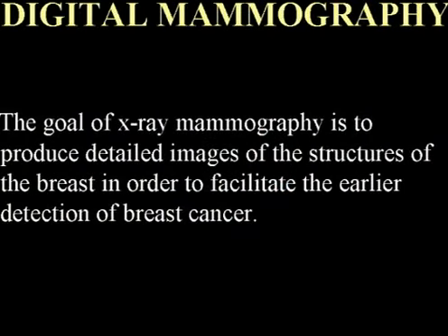So the implications of going to digital are significant, and we'll talk about that as well. When we think about mammography in general, we have to keep in mind the goal as we're thinking about such a huge endeavor as completely switching over our equipment. Clearly, the idea is to produce detailed images of the breast in order to help us detect breast cancer earlier and thus afford the individual the possibility of a cure.